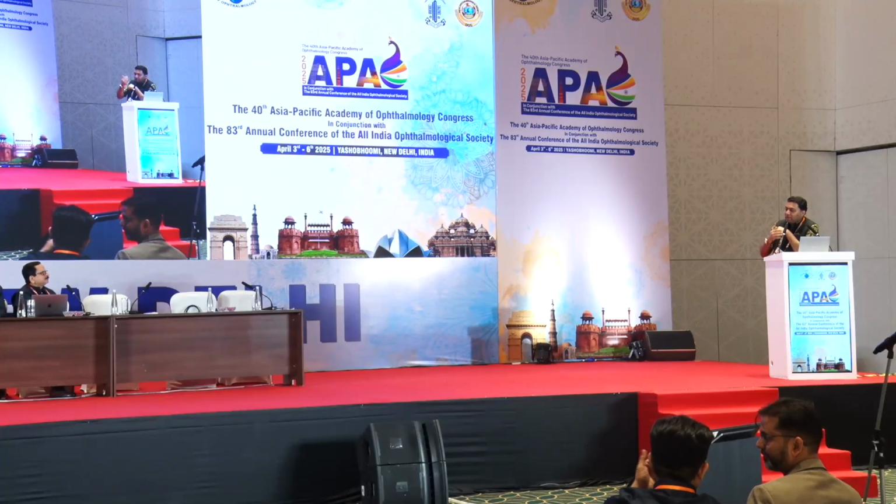For example, if Dr. Jatlani wants to do a LASIK on an amblyopic eye tomorrow, this would be the way to go, because an amblyopic eye has a huge amount of lens compensation. He treats the power of -6, but the lens is still compensating. The whole amblyopia in a child gets completely nullified. So if you do this, you have looked at the entire optical system, and he can see how much of the lens is actually playing a role. So it's a huge leap in the way we look at refractive modeling.